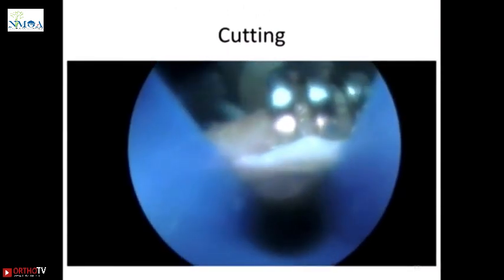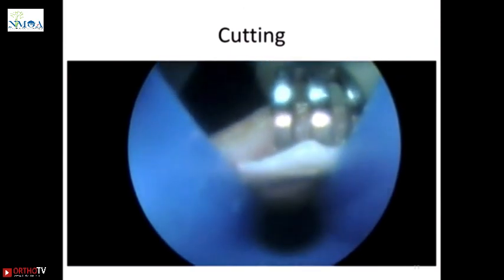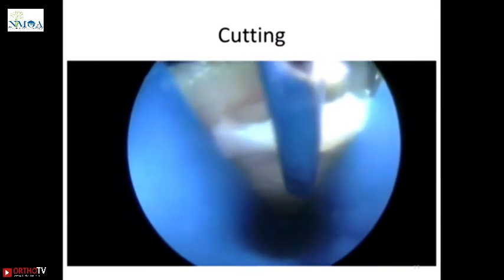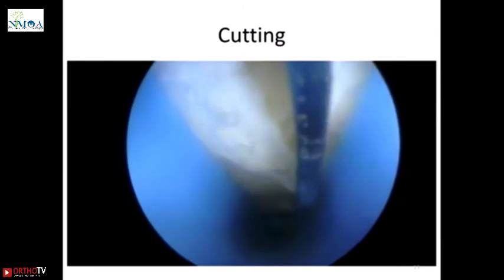You can check that this is the carpal tunnel. I have checked the carpal tunnel. Then the knife will come, and gradually the knife is going and we are cutting the ligament.